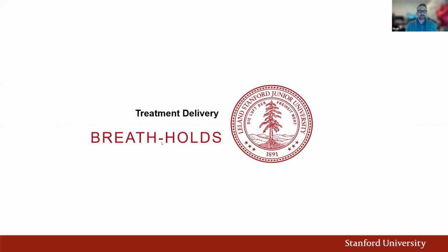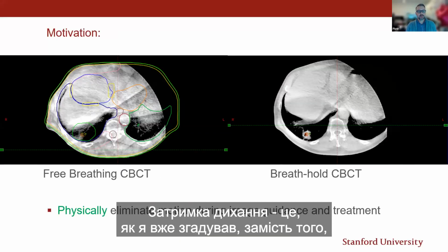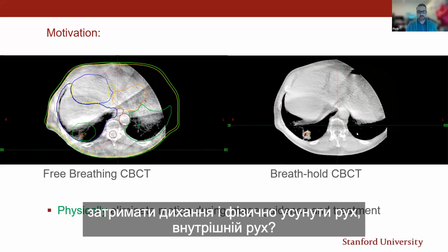Okay, so a little bit about breath holds. Breath holds are, as I kind of mentioned, instead of gating the beam, or instead of living with the patient in free breathing where a lot of motion is blurred, why don't we just ask the patient to hold their breath and physically eliminate the internal motion.